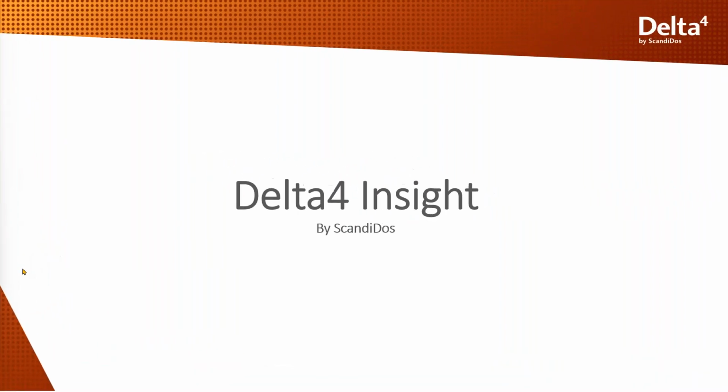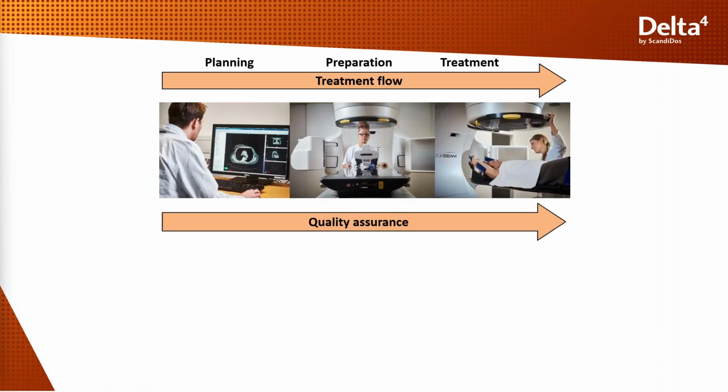The topic today is Delta4 Insight, our new secondary dose calculation software for verification of the treatment planning system. So what is Insight and how does it fit into your QA program that you have today?